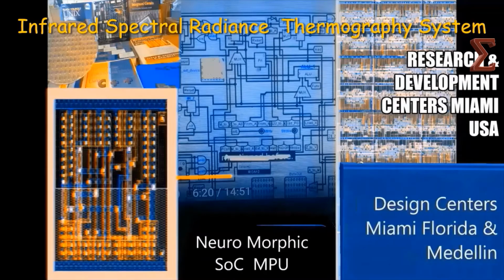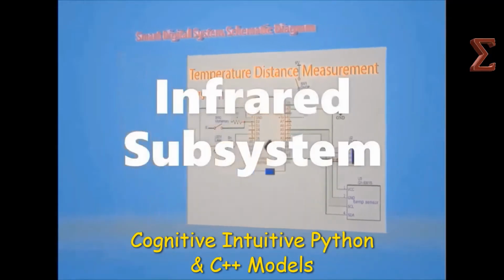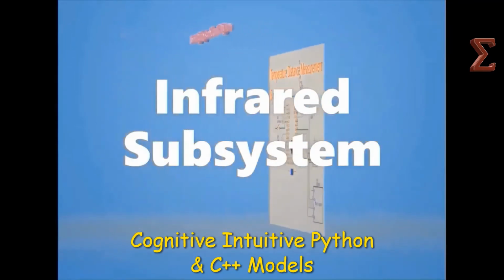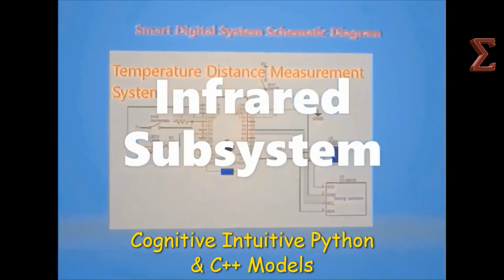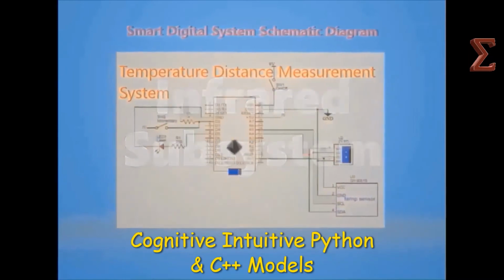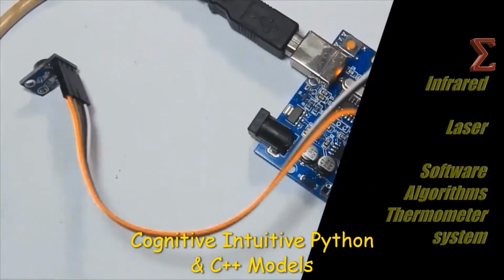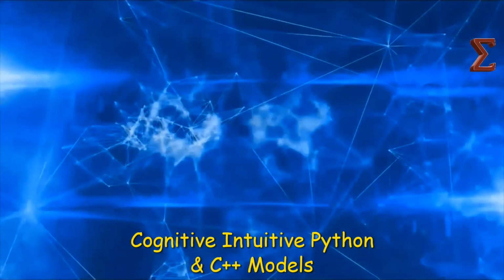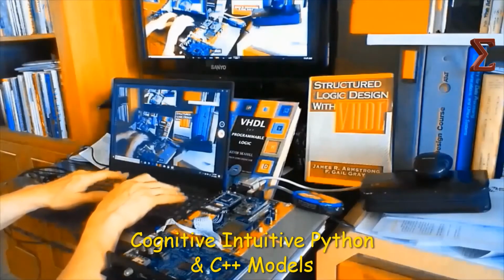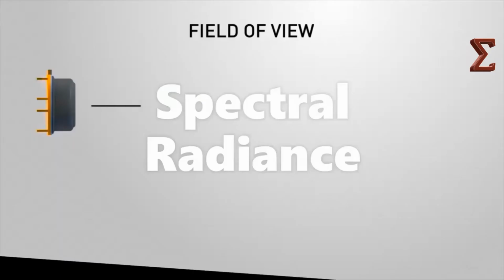the radiation of the measured object, and the feedback source is adjusted according to the modulator and input to the infrared detector system. The difference between the two signals is amplified by the inverse amplifier, and the temperature of the feedback source is controlled so that the spectral radiance of the feedback source is the same as that of the object being measured.